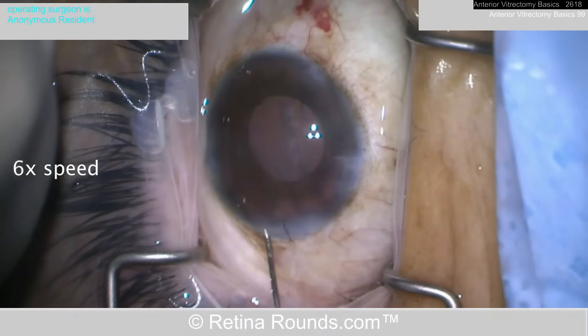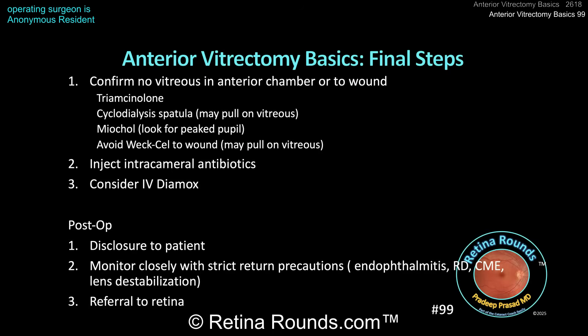Triamcinolone is used to confirm there's no vitreous in the AC — it looks nice and clean. To recap the final steps: confirm no vitreous in the anterior chamber or wounds using triamcinolone. You can also use a cyclodialysis spatula to sweep near the paracentesis or corneal wounds, though be cautious as this may pull on vitreous and increase traction on the retina. Miochol is a good idea to constrict the pupil, stabilize the sulcus lens, and help identify a peaked pupil that would indicate residual vitreous. Avoid using a Weck-Cel to test the wound as it could cause excessive retinal traction.